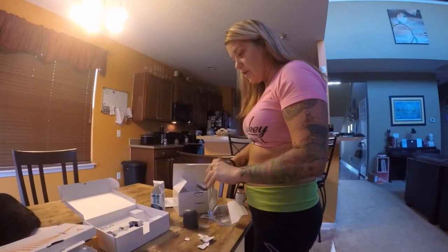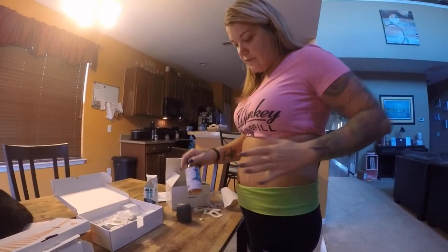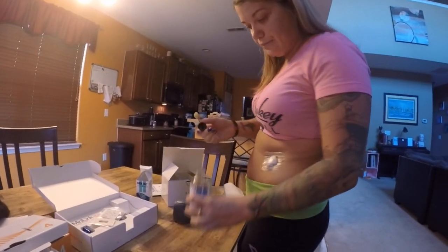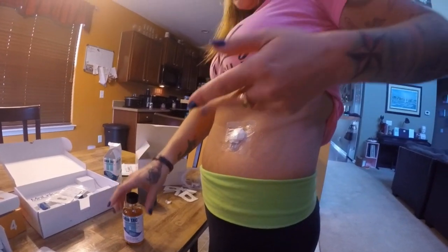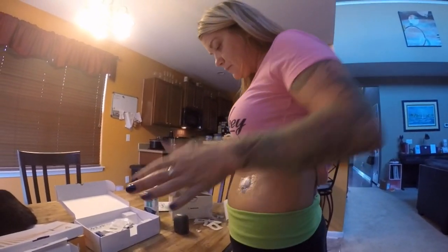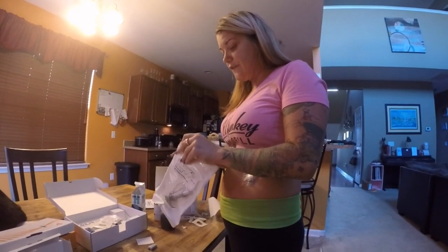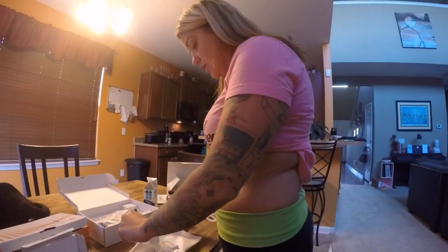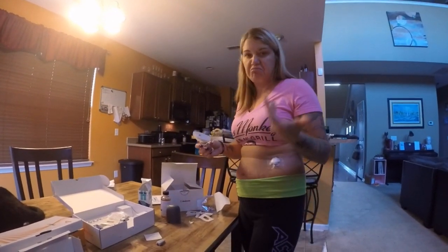Since I wear the Dexcom for about a month, I use skin tac — a liquid adhesive — to help the sticky stuff stay on better. I apply it in about a circle and let it dry. I should have used alcohol wipes first but forgot. The insertion process is completely different from the Enlite. In three months of using the Dexcom I've never accidentally pulled out the sensor. With the Medtronic Enlite I probably pulled it out over a dozen times.